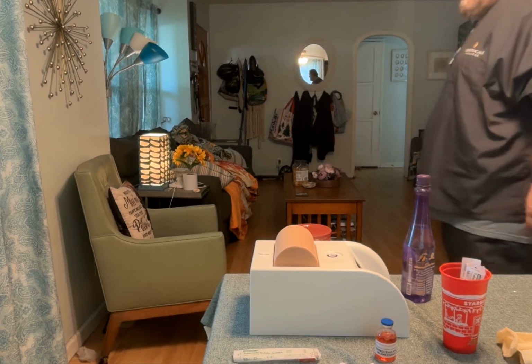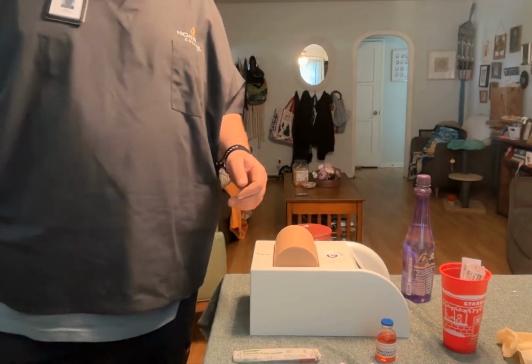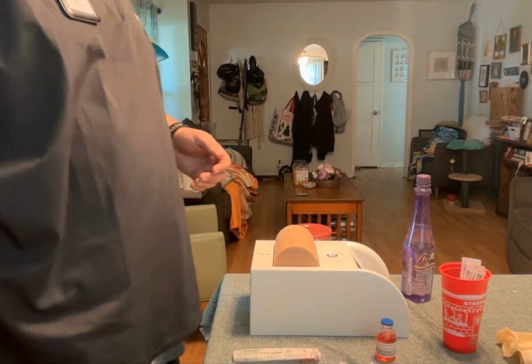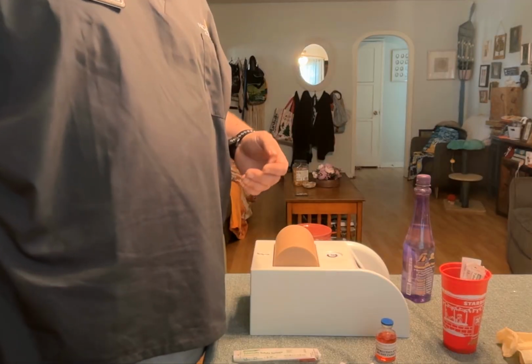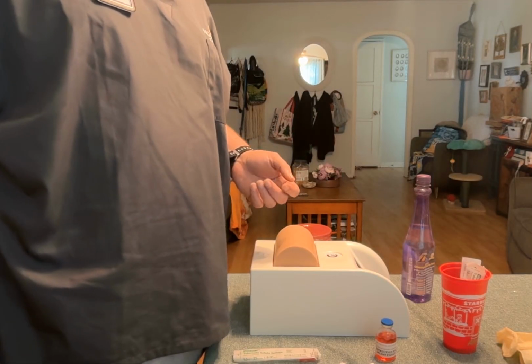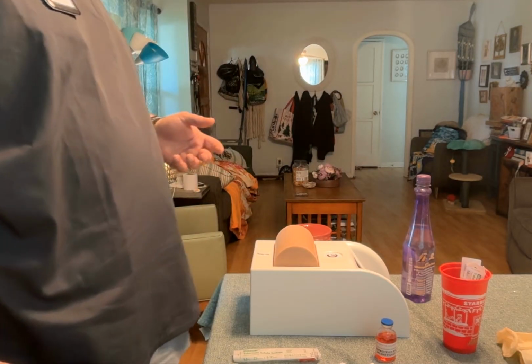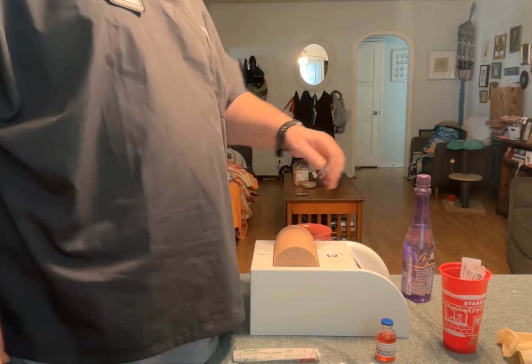Provide privacy. Hello, Mrs. Patient. How are you today? Patient says she's fine. I explain my name is Neil. I'm going to give her a heparin shot that the doctor ordered, which is a blood thinner. I explain what a blood thinner is and how it can prevent clotting.